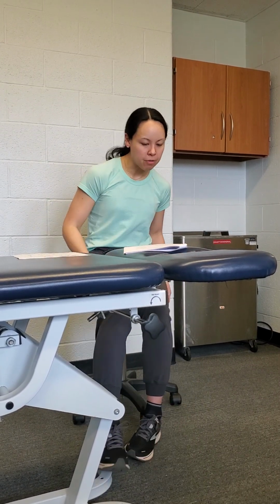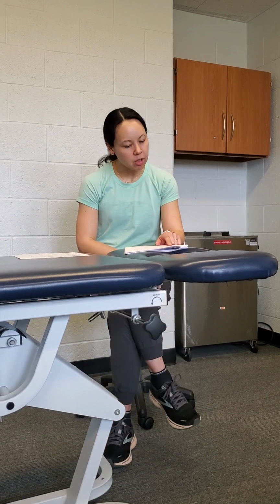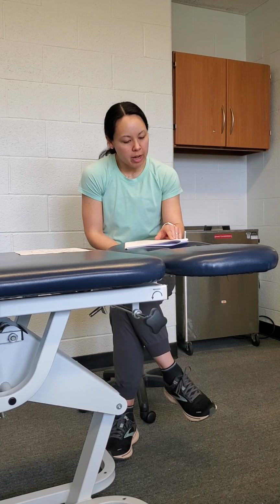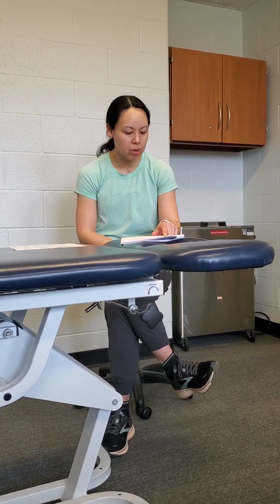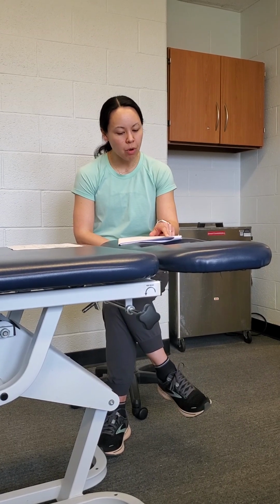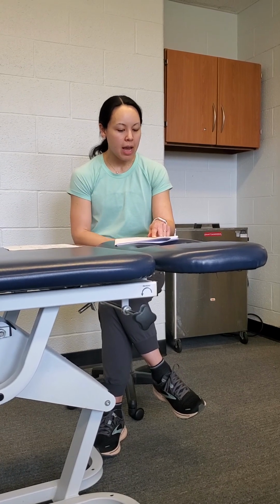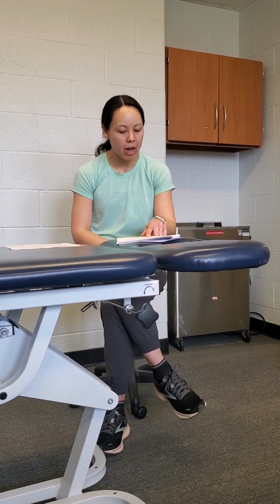So for passive BFR, like I said, it's early post-op or post-injury. You just let the tourniquet do the work. The pressure is going to be about 70 to even 100% limb occlusion pressure. The protocol for that is 3 to 5 bouts of 5 minutes on, so the cuff is on, and then 3 to 5 minutes off. So it's the same ratio of the machine working to the rest when it's turned off.